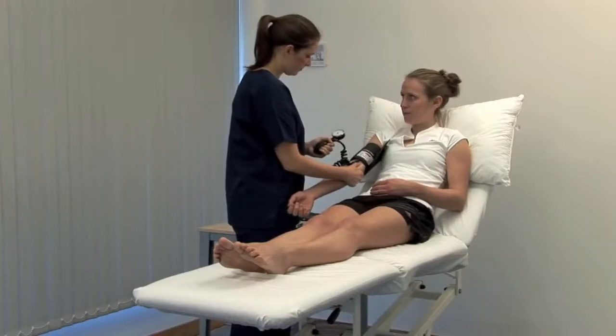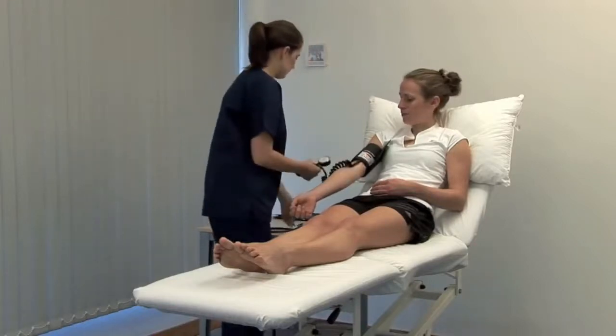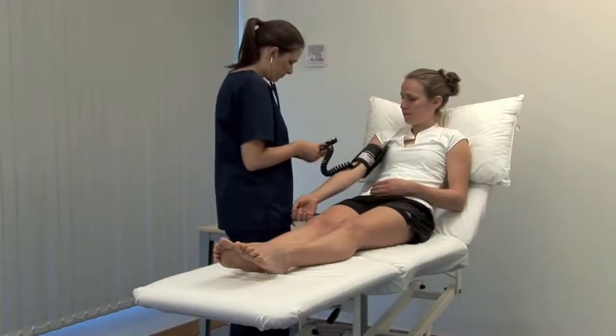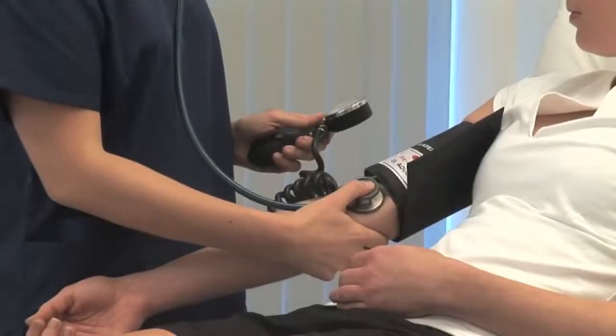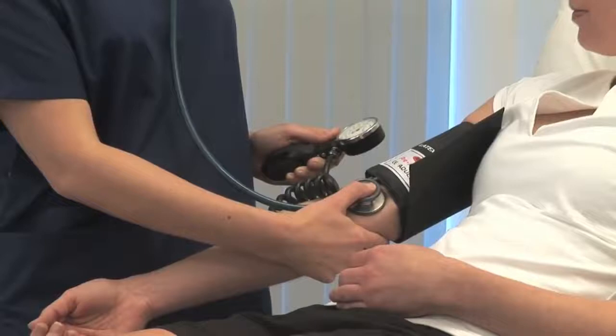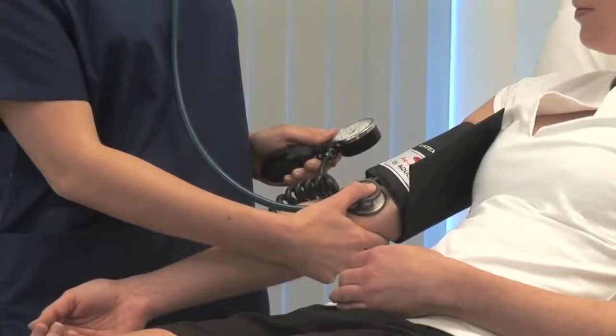Inflate the cuff by a further 30 mmHg and then listen with the stethoscope diaphragm over the brachial artery. There should be silence initially. Slowly deflate the cuff by 2-3 mmHg per second.